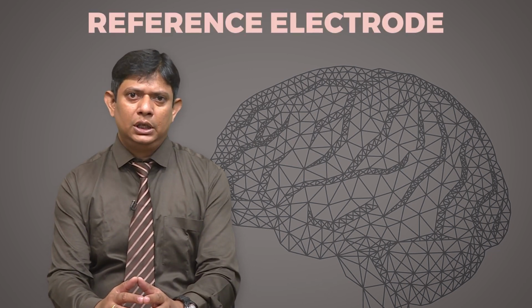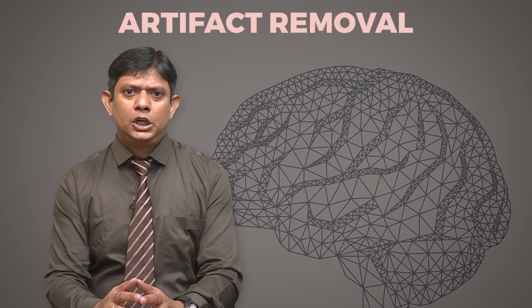Reference electrode. EEG signals are relative, meaning they are measured with respect to a reference electrode. The choice of the reference electrode can impact the interpretation of the recorded data. The next factor is artifact removal. EEG recordings can be affected by various artifacts such as muscle activity, eye movement, and electrical interference. These artifacts need to be identified and removed to extract the true brain activity.